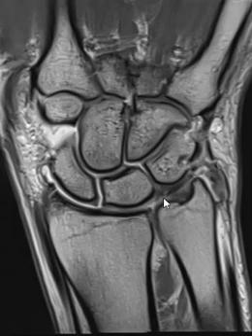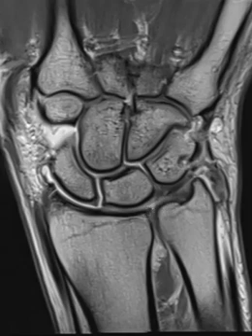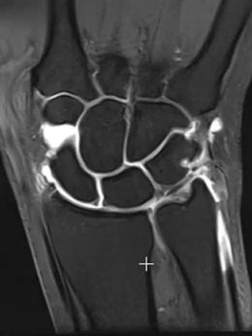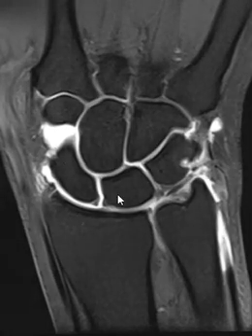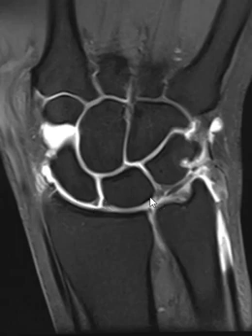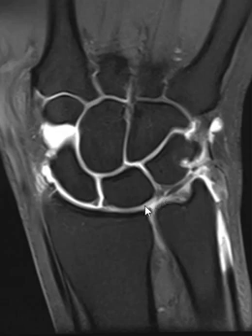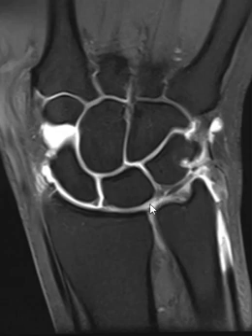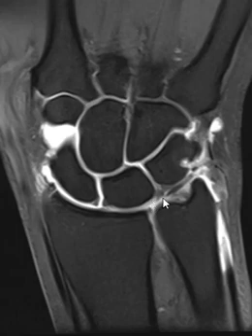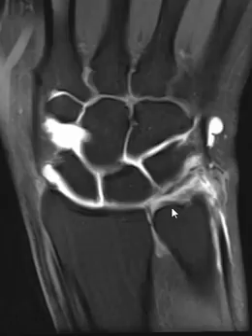That's exactly what this patient has. There's a big hole right in the central part of the TFCC here. This is a T1-weighted sequence — everything white here is contrast. We can see the contrast here, and instead of seeing a nice black band of TFCC, we see the central disc is completely gone.